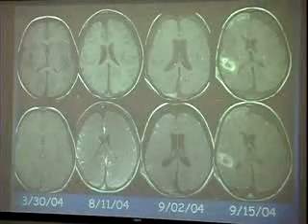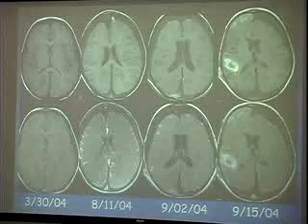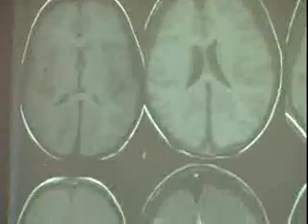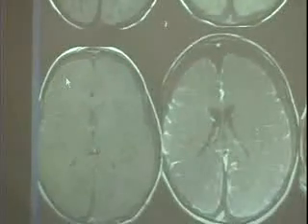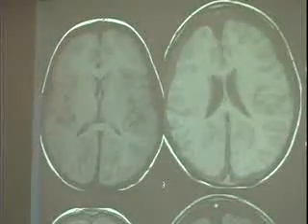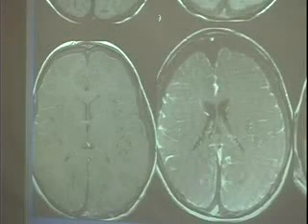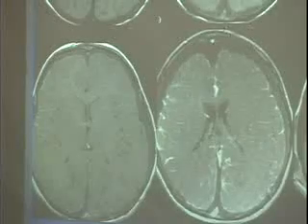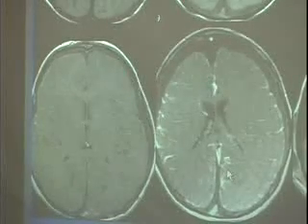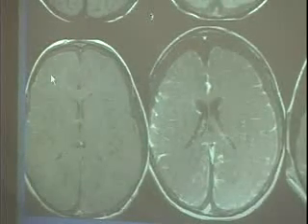On T1 sequences without and with contrast, myelin is bright and CSF is dark. Initially the brain looks fairly normal, but with contrast we saw leptomeningeal enhancement. The initial presentation involved subdural collections with an abnormal right frontal leptomeningeal process with contrast enhancement, which then progressed to hemorrhages in that area. By the time we see hemorrhages in the right frontal region, leptomeningeal enhancement was visible very diffusely throughout the brain, suggesting that the enhancement process preceded the presence of hemorrhages.